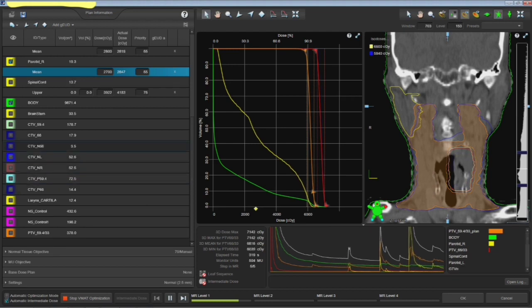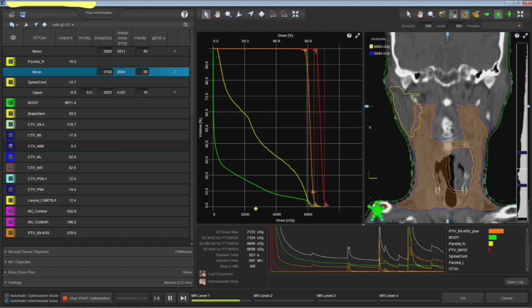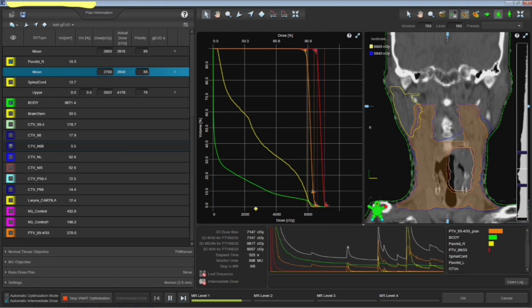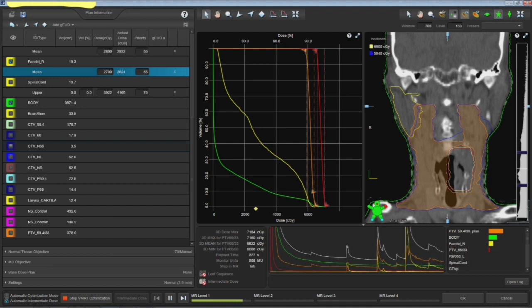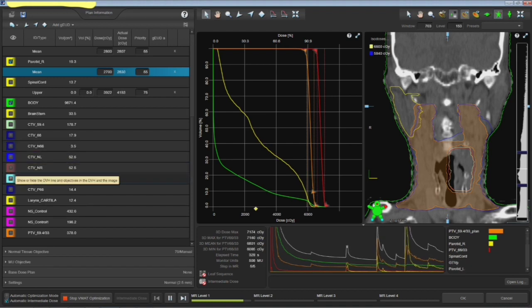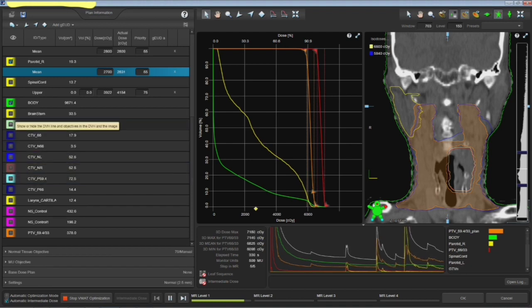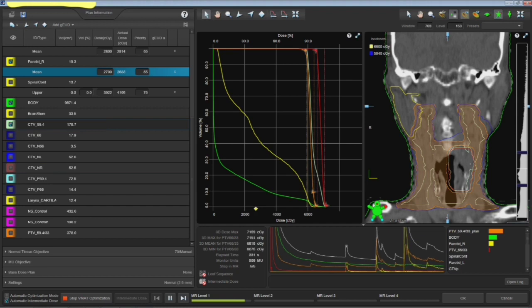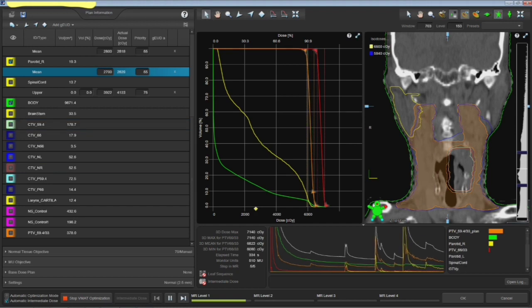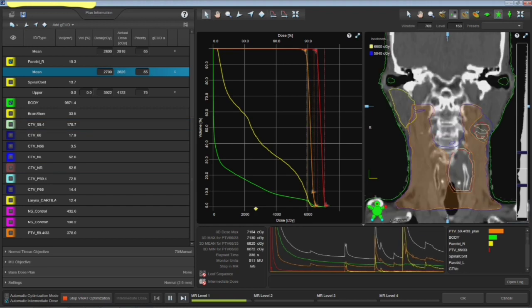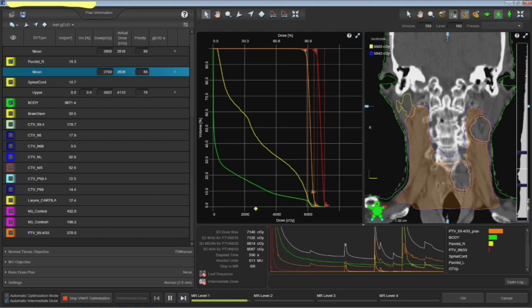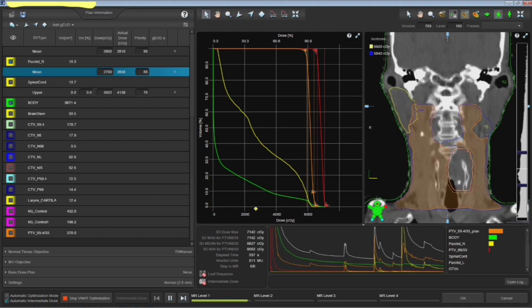You can see the CTV as well and it depends on the clinicians that how much underdose or overdose, whatever it is, sorry not overdose, how much the dose can be underdosed to that PTV region. And then you can see even CTV whether it is okay or not. It depends on the clinician. They have their own practice.